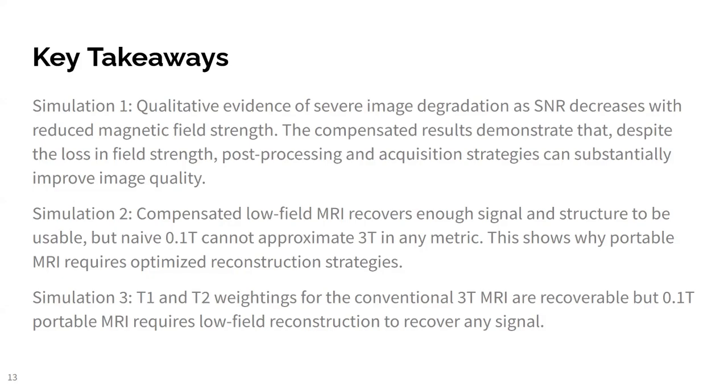And Simulation 3 showed T1 and T2 weightings for conventional 3T MRI are recoverable, but 0.1T portable MRI requires low-field reconstruction to recover any signal.